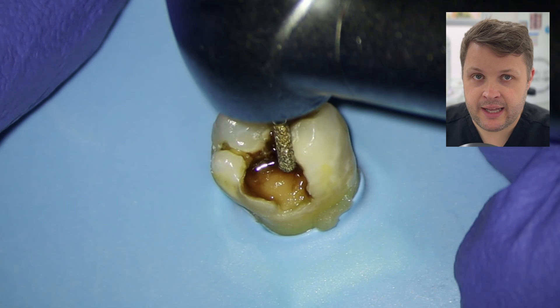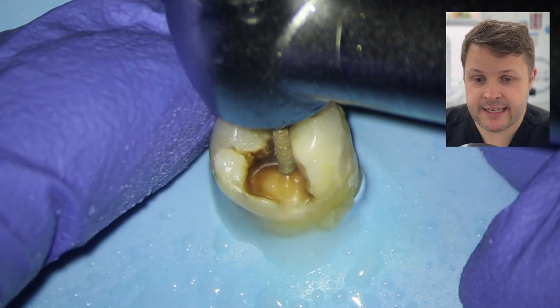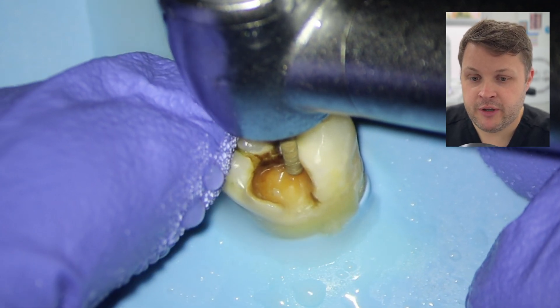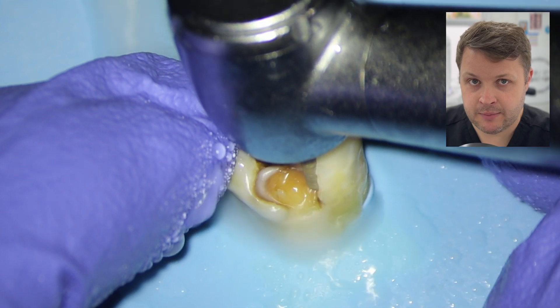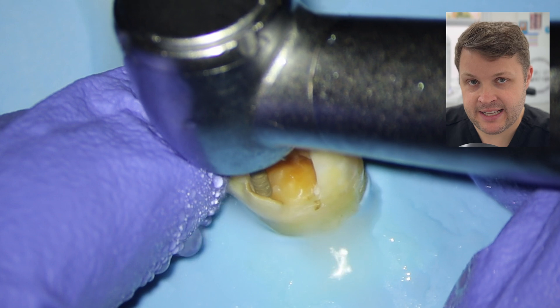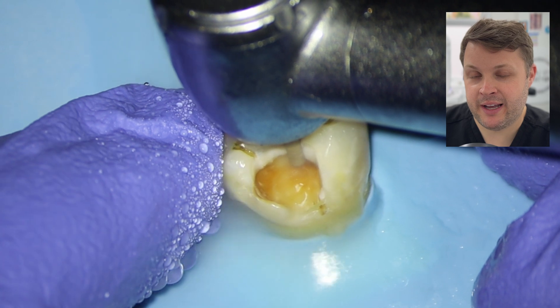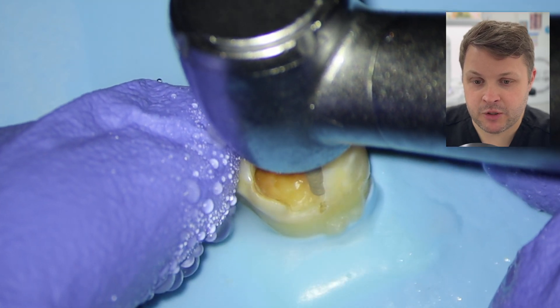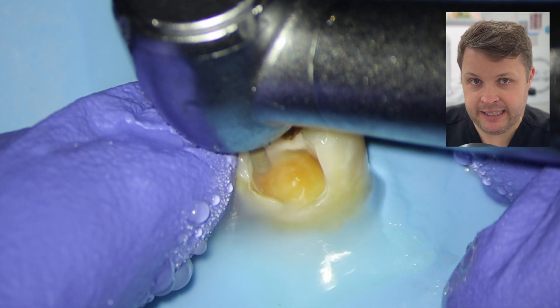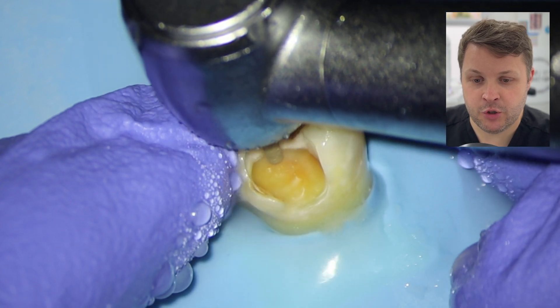So I think in the first instance, when I am going to dress a tooth ready for it to be root canaled at a later date, I'm just going to go straight in with my fast handpiece and I'm just going to remove most of the undermined enamel. I'm not really going to touch any of the sort of decayed dentin, although sometimes I might just remove some of that by removing some of the undermined enamel. I want to just get the vast majority of the enamel that we know is completely gone just off the tooth and give it a little bit of a clean up all the way around.